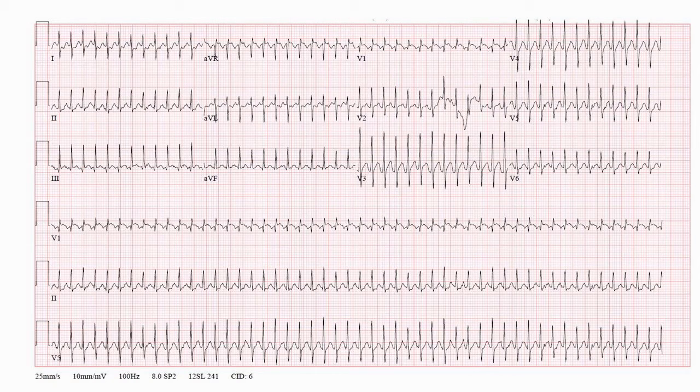So a lot of times when we're comparing adults versus children, the stickers that these leads or wires are attached to are pretty large in adults. So we cut them down. And really it seems like the only reason for that is we need contact to the skin. And in a baby, it's a very small surface area. So cutting the stickers in half doesn't really change anything with that electrical conduction or the pickup of the electrical activity, does it?